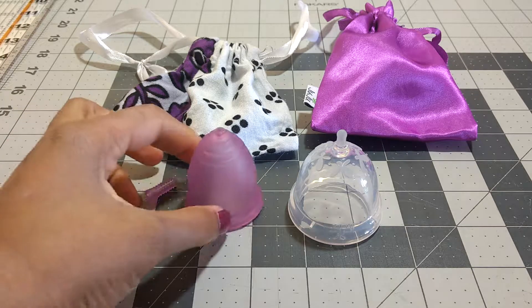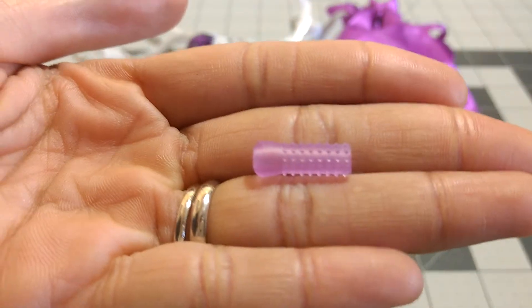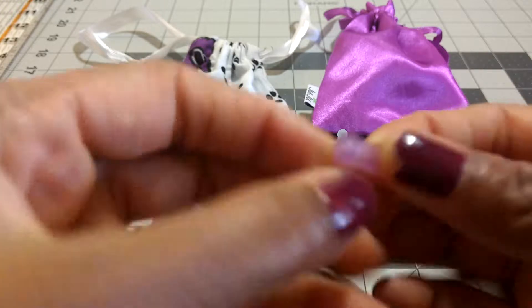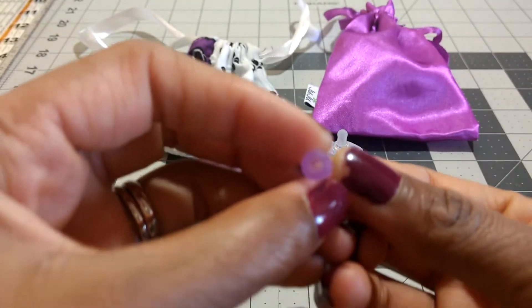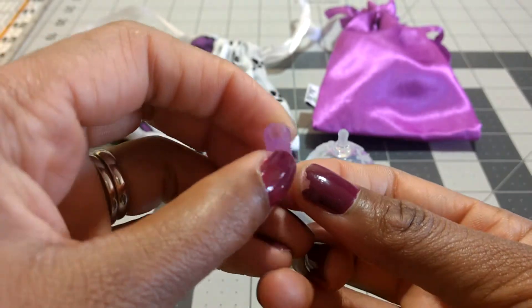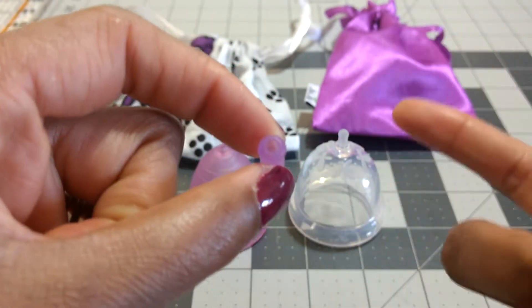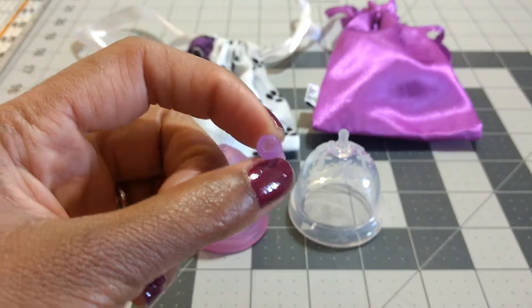First things first, I did trim the stem on my Ruby Cup, so I'm just going to show you that stem on its own. You can see it has these notches on it that will help you get a good grip, and it is a hollow stem. I'm actually curious as to how hard it is to clean, but I've never had to clean it, so I don't know — I took the stem off of mine pretty much right away.